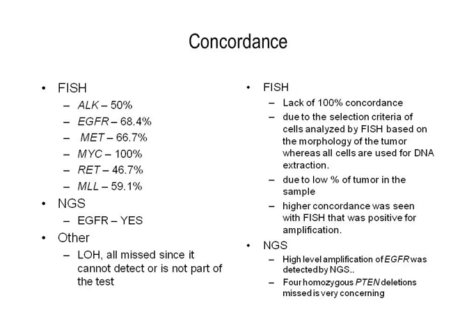As far as NGS concordance is concerned, we see, as I showed before, the EGFR amplification is very easily detected, but the other ones are missed because of the fact that we don't have a total whole genome backbone which we can use to normalize. Specifically, we saw some concerning genes which were found by OncoScan arrays but were missed by NGS.